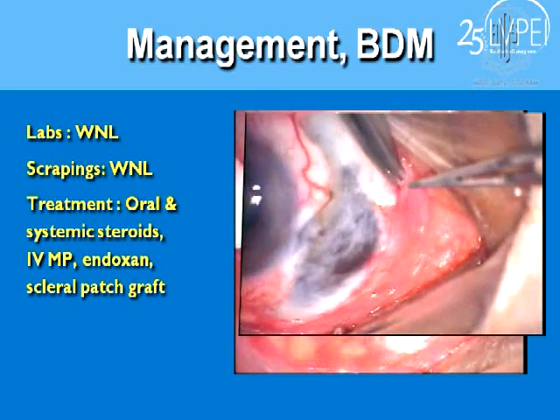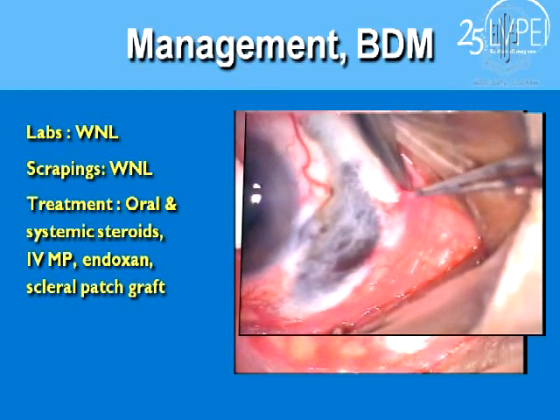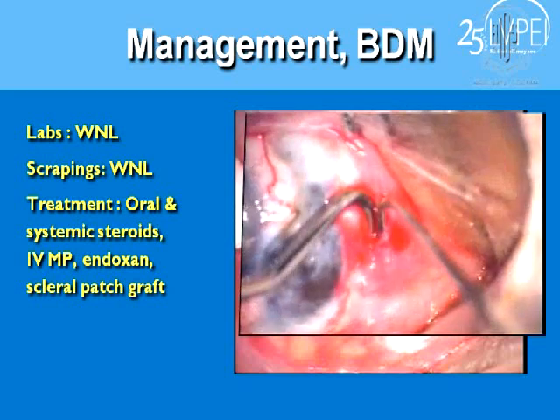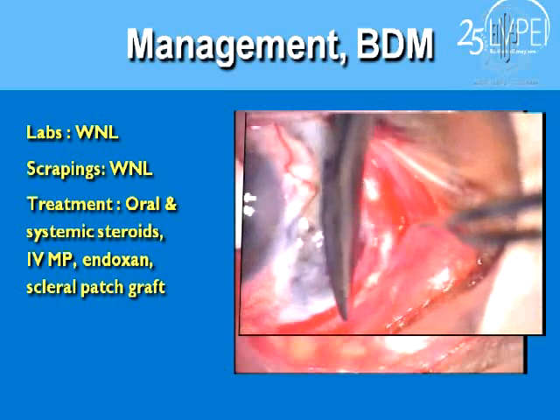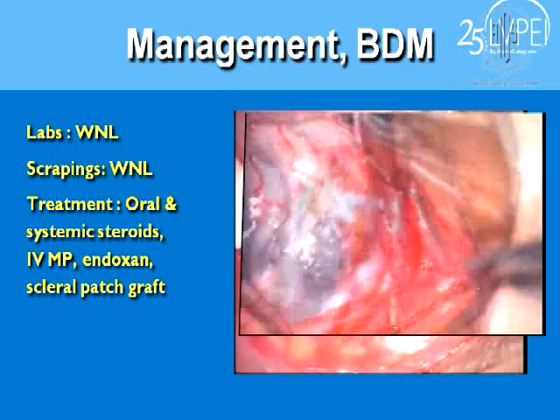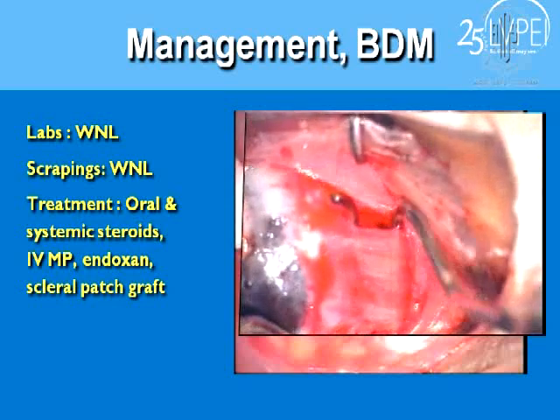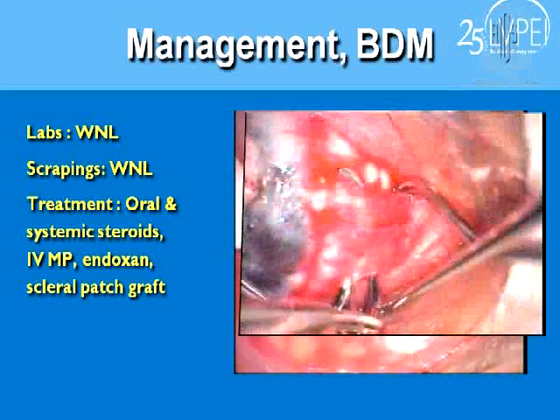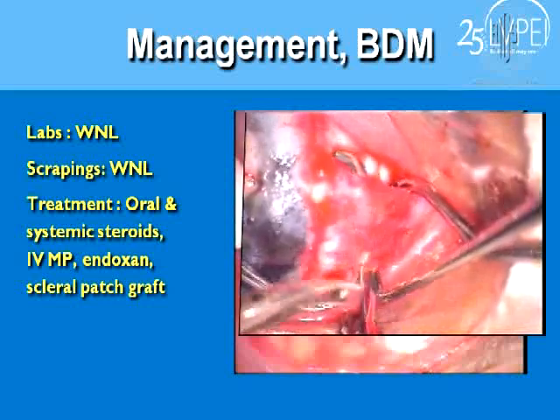And this surgical video shows what my colleague Dr. Sangwan did. We wanted to explore and see what was the posterior extent of this area of thinning. So he saw that it was involving the rectus muscle, so he had to disinsert the muscle, and of course in the end it was put back in place. We actually had to use the help of the squint colleague to do this. So this part shows that the muscle was disinserted.